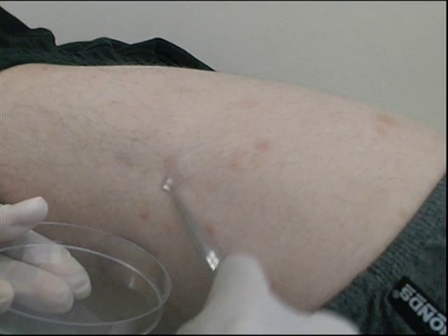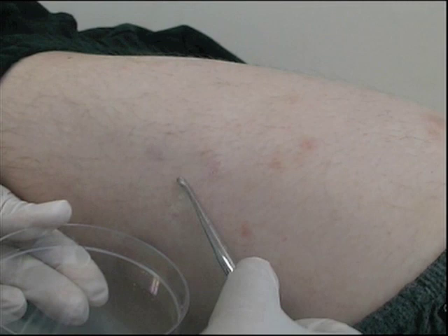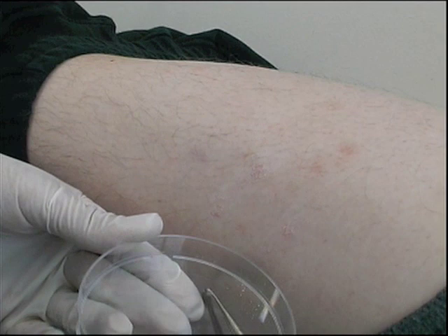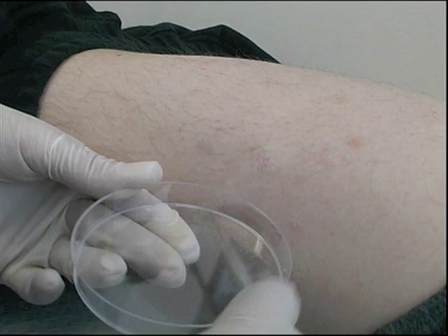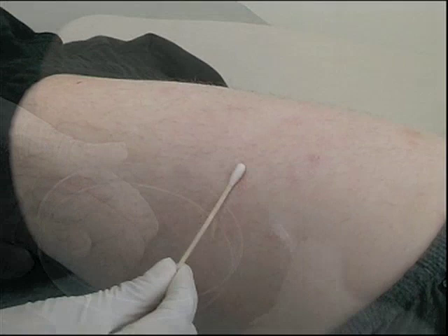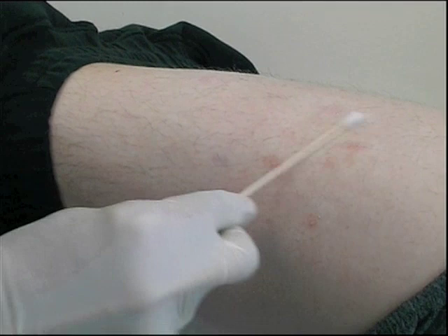Here we see a bone curette being used to scrape a diffuse scaly skin lesion into a plastic petri dish. However, a black collection card could also be used to collect the skin scales. A swab is then used to pick up the loose skin scales.